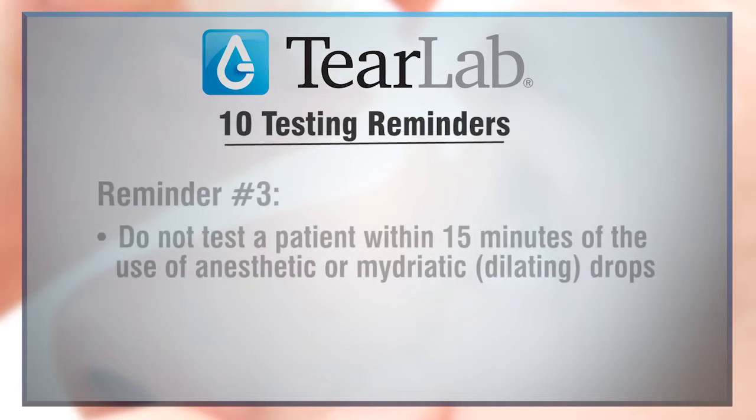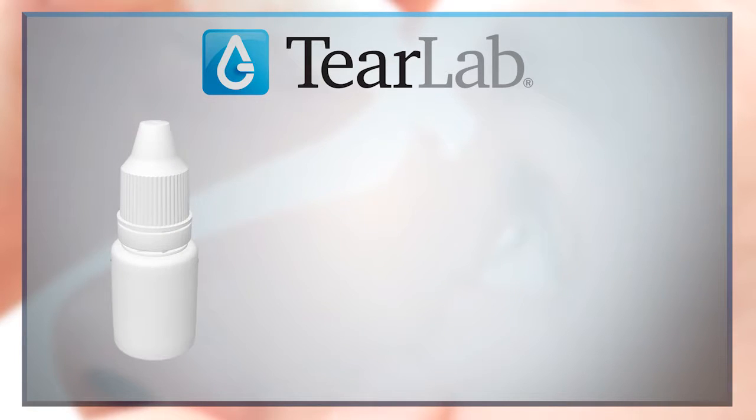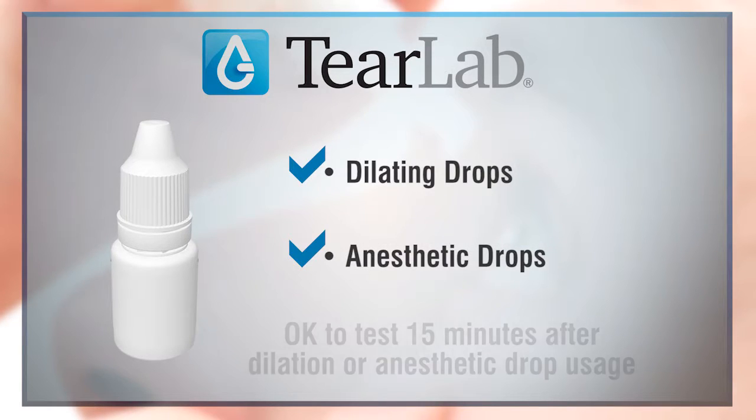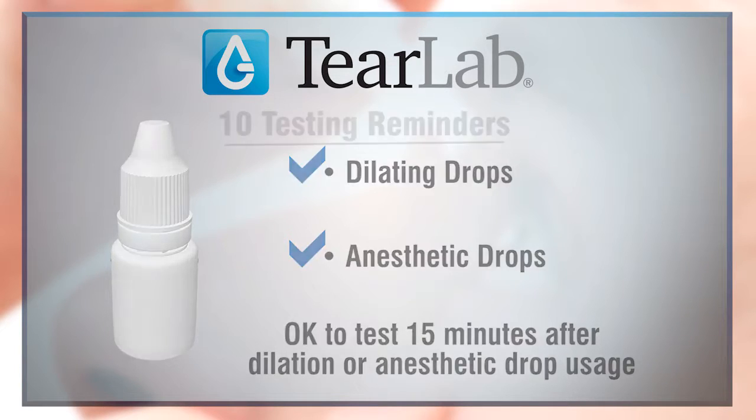Reminder number 3. Do not test a patient within 15 minutes of the use of anesthetic or mydriatic dilating drops. Eye drops used by the clinic staff to dilate or anesthetize the eye will dissipate rapidly. After 15 minutes, the natural tear fluid will return and will not affect the test results.